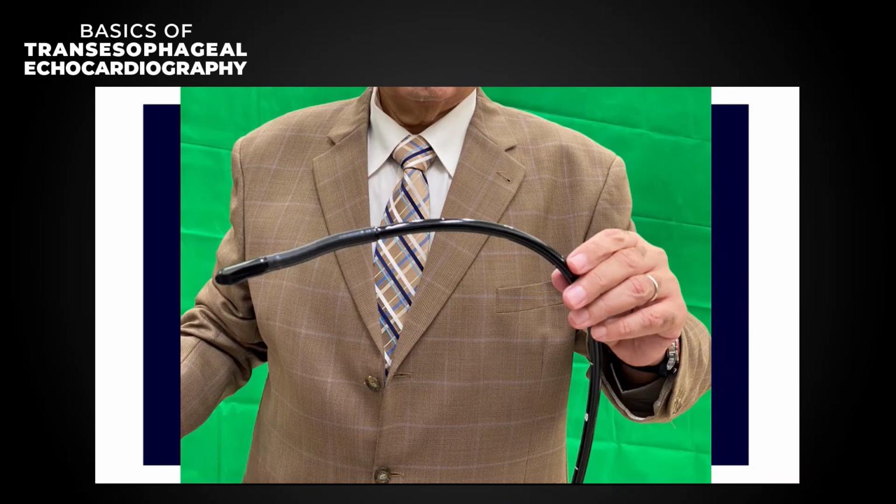During this angulation, I decide which structure I'm going to focus on: the aortic valve, the left atrial appendage, or the interatrial septum. For the septum, I should use the bicaval view.